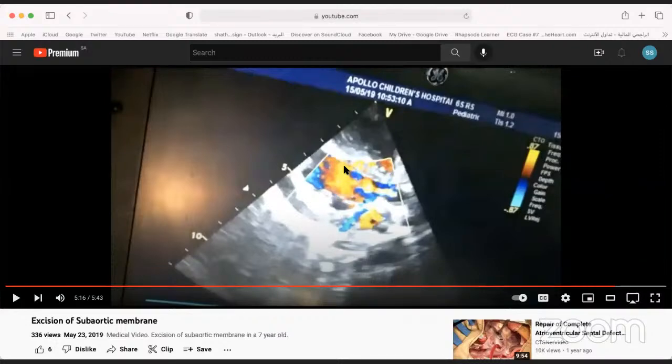Yes, those two factors are important, but an additional one is the location of the membrane, if it's less than half a centimeter from the annulus, or if there's a creeping part of the membrane on the leaflet. For those who attended surgery, they can see us sometimes milk it out of the leaflet itself. One more comment about the surgery here, Shada, they have used an 11 blade. Our experience is much better with blunt dissection most of the time, and rarely do we use sharp dissection.